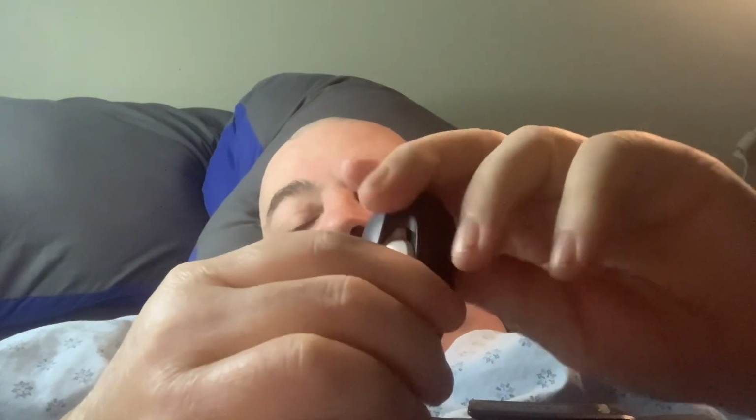But for a lot of you, let's see if I can get it here. Is that it? That's it right there. This is the little transmitter for my pump. It goes onto the charger, and the charger flashing here tells us that it's doing its job. I just thought I'd show you this for a change. It's usually taped to my body, so you don't really get that much time with it.